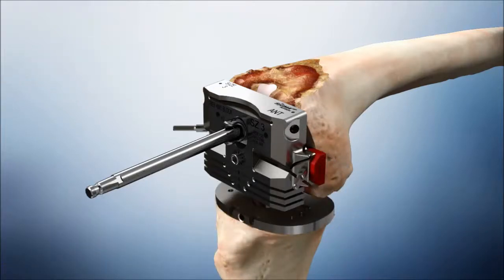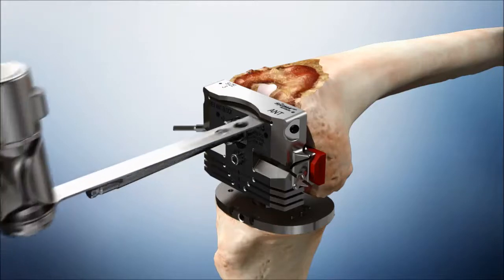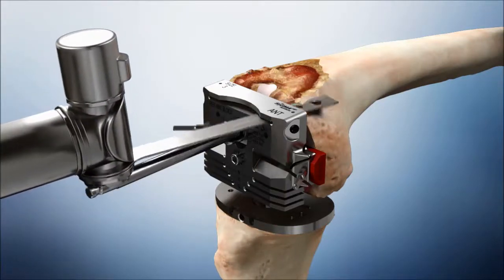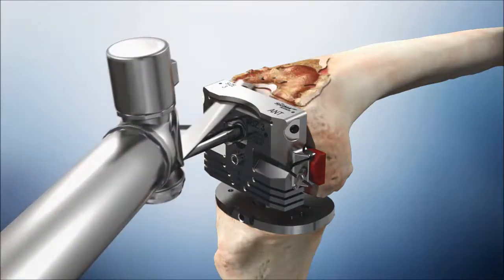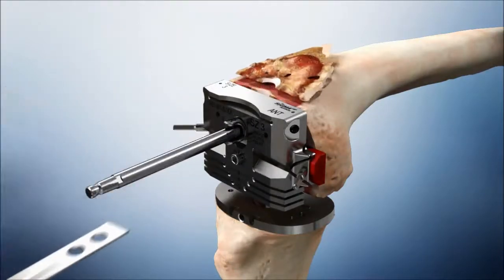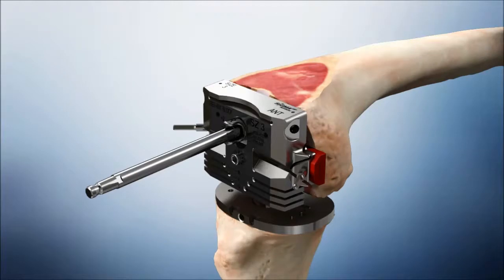Make the anterior, posterior, anterior chamfer and posterior chamfer resections. Posterior augment resections, if necessary, will be made at this time.